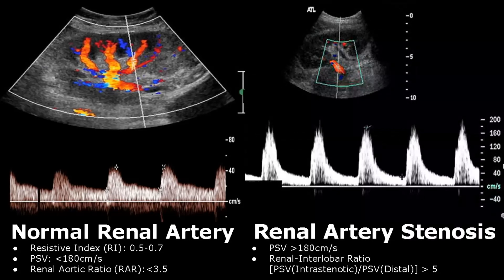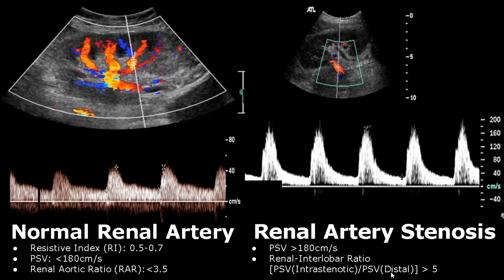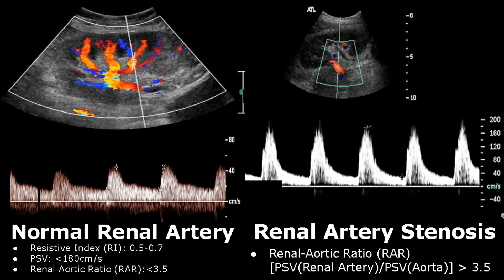Renal artery stenosis is the narrowing of the renal artery. The most common cause is atherosclerosis. The PSV will be greater than 180 centimeters per second — here it has reached 200 centimeters per second. The renal interlober ratio is calculated as PSV of the intra-stenotic region divided by PSV at the site distal to the stenosis. In renal artery stenosis, this ratio is greater than 5. The renal aortic ratio — PSV of renal artery divided by PSV of aorta — is greater than 3.5 in stenosis.